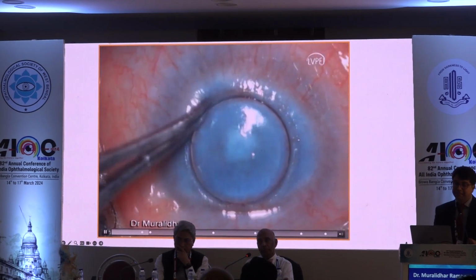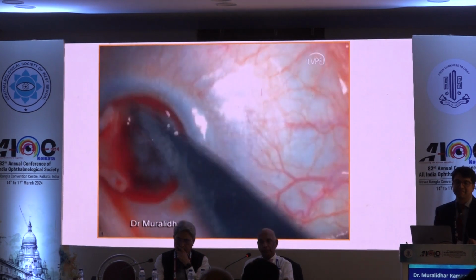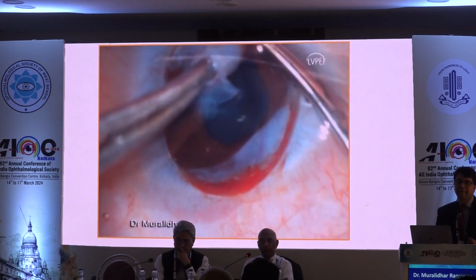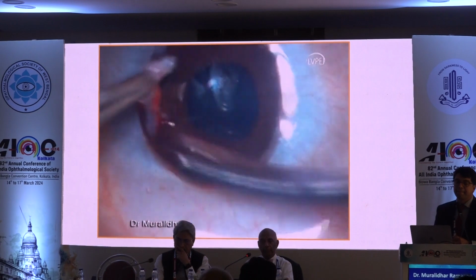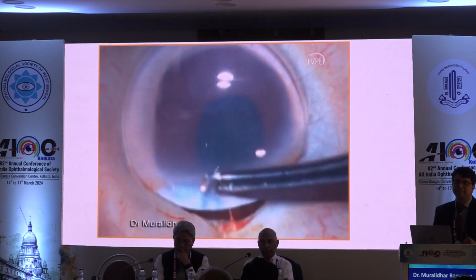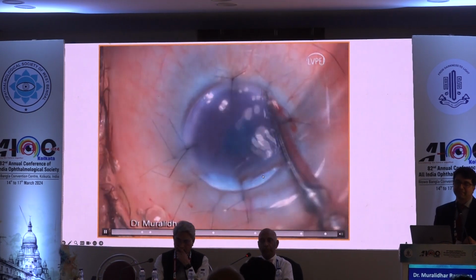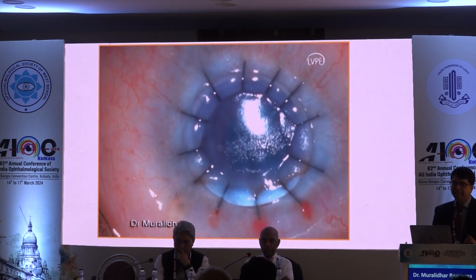We need to ensure and respect the anatomical landmarks. We are not only preserving the recipient's limbal stem cells, although they are abnormal, we are also supplementing donor limbal stem cells. Thankfully, we have access to high quality donor tissue, as Dr. Rao was mentioning, and these donors should be very young, less than 30, with a death-to-preservation time of less than 6 hours, and at least one quadrant of healthy limbus. I generally use the superior limbus, which is well protected under the upper lid, oriented appropriately. The rest of the steps are similar to any transplantation.